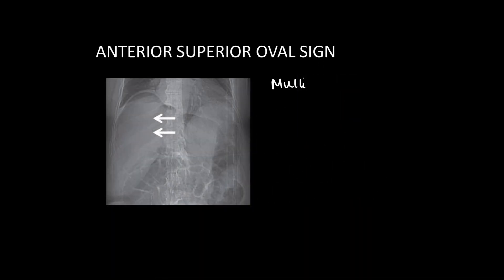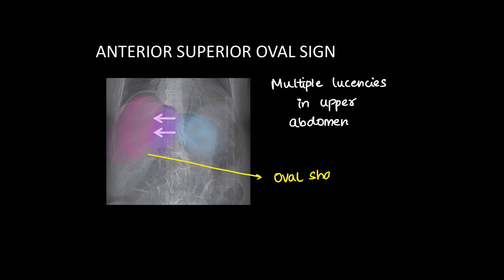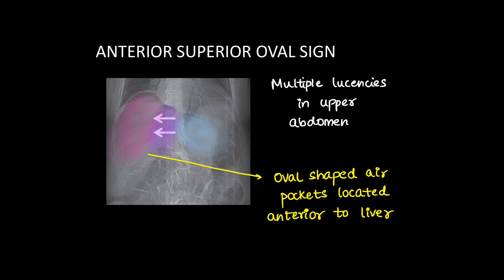Another named sign related to the superior quadrant of the abdomen is the anterior superior oval sign, in which we can see oval pockets of air collecting in the superior quadrants of the abdomen or beneath the diaphragm — oval-shaped air pockets anterior to the liver.